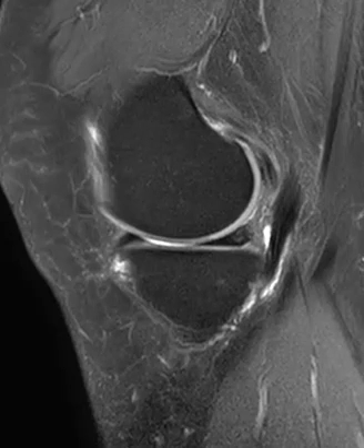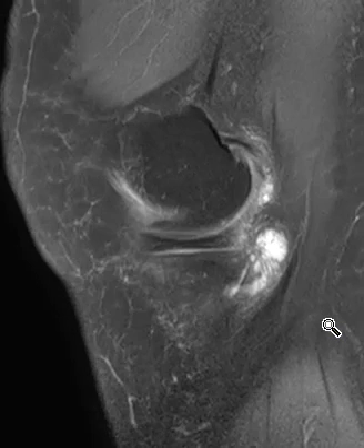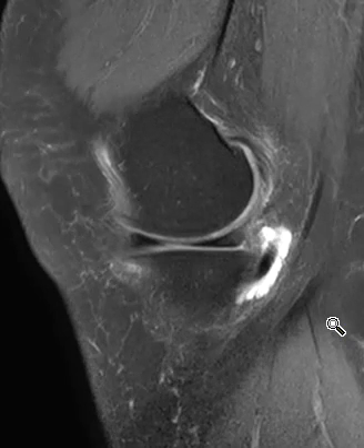Hello, this is Dr. Gay from First Lake MRI. This is a 55-year-old female with knee pain and no history of injury.